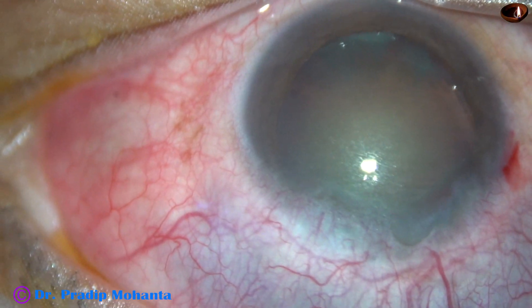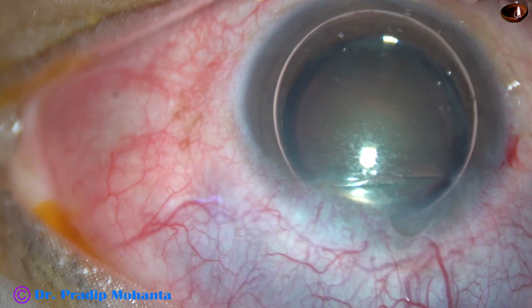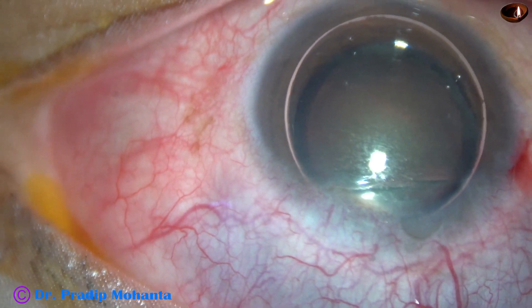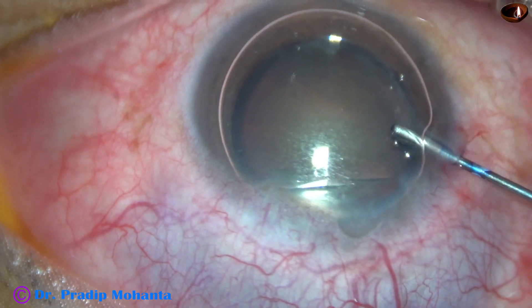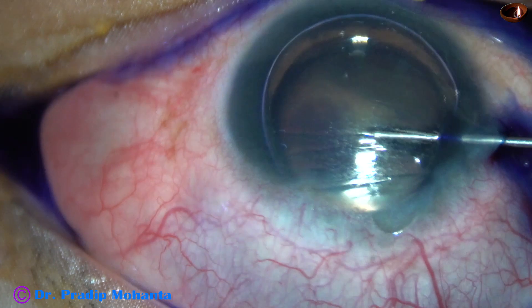So I am going to avoid this area for incisions. I made the side port at 9:30 to 9:45 o'clock.